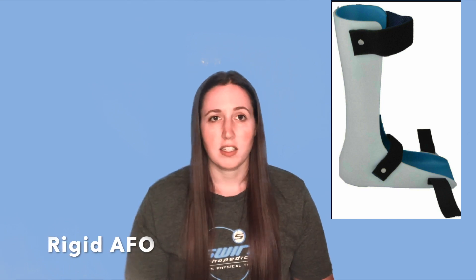AFOs more typically come in a plastic version. This allows a little bit more flexibility so it's not quite as rigid, and it's a little bit lighter which is nice for a lot of patients. In this plastic version you can still get a rigid AFO — it does not have an articulated joint, but the plastic does allow some amount of bend, and this usually has a longer foot plate which can decrease some spasticity.